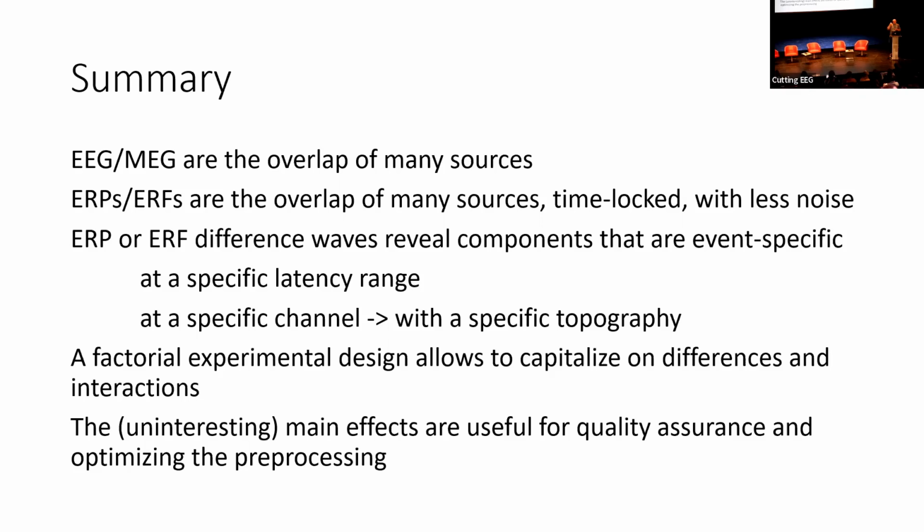I shortly mentioned that we also have this activity which is not time locked. And one of the things that I'm pretty sure that we're going to see this afternoon is that if we do time frequency analysis or wavelet analysis on epoch data, the event-related responses, so the ERPs, are also going to show up in the wavelets decomposition.